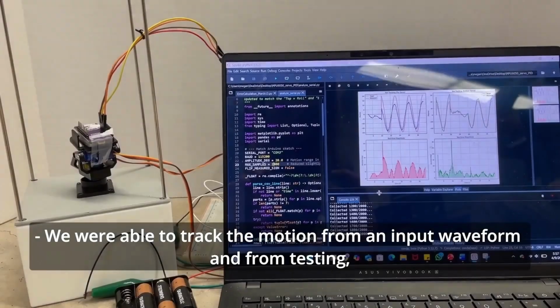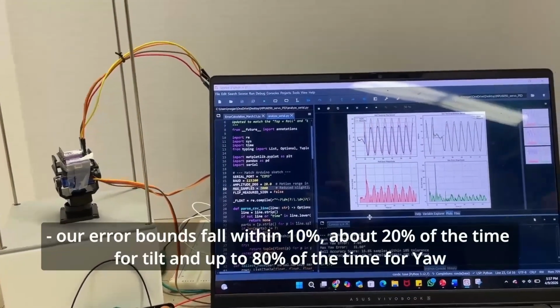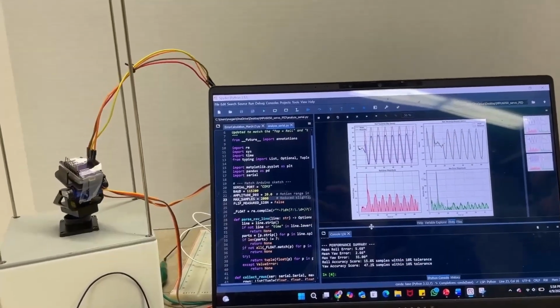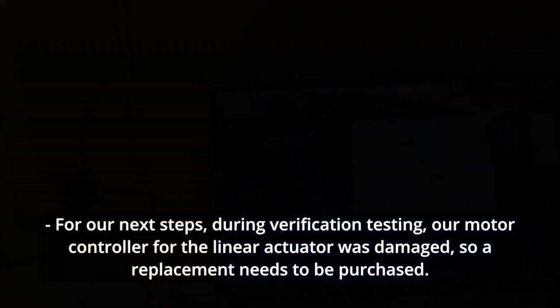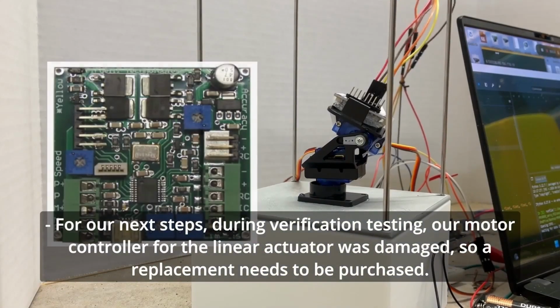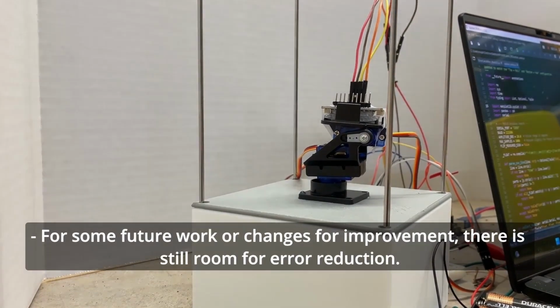We were able to track the motion from an input waveform, and from testing, our error bounds fall within 10% about 20% of the time for tilt and up to 80% of the time for yaw. For our next steps, during verification testing, our motor controller for our linear actuator was damaged, so a replacement needs to be purchased. For some future work or changes for improvement, there is still room for error reduction.